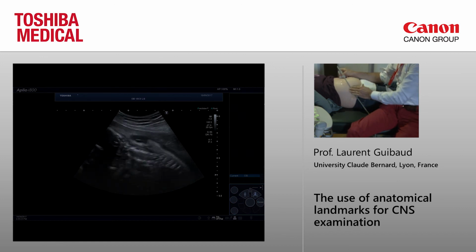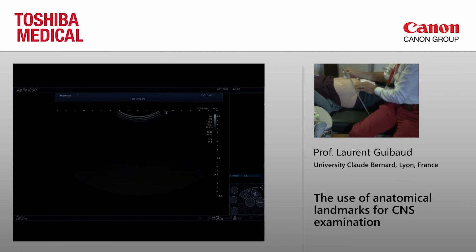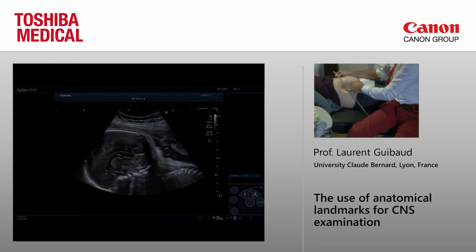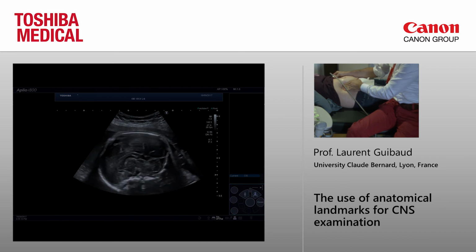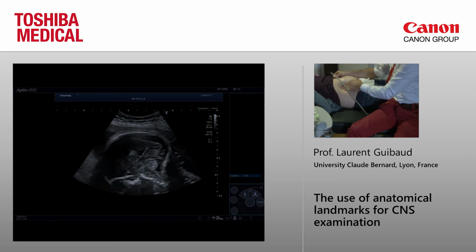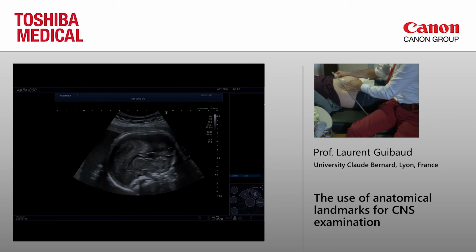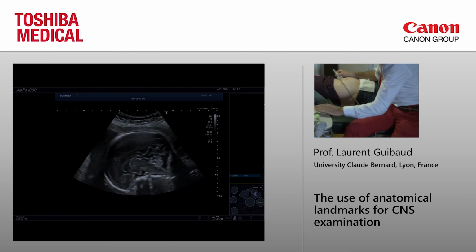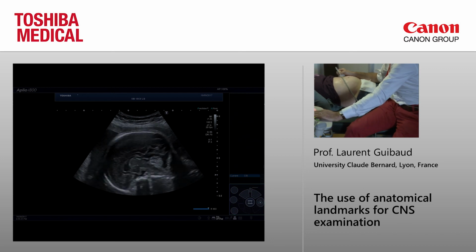Okay. So when there is a Blake's pouch cyst, I will try to be sure whether my vermis is complete or not. This is better. You see, when you are not strictly on the vermis, it's very easy to see because it's less echogenic. Here, I'm sure that I'm on the vermis.